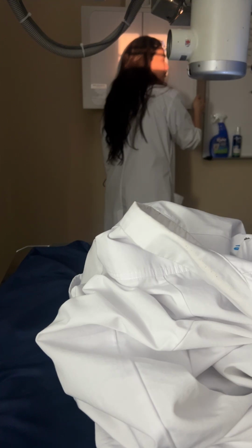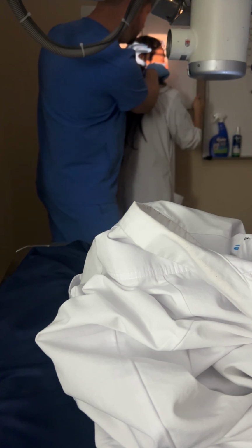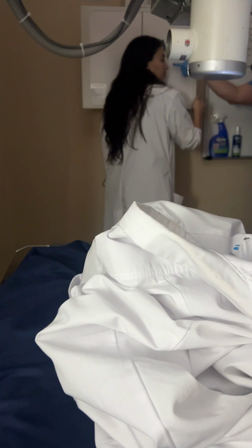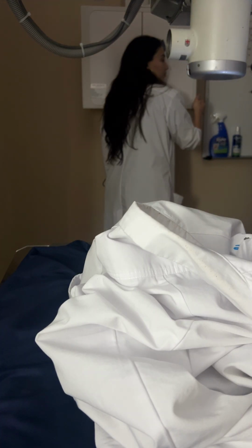Questions? So 2 lines. Infraorbitomeatal line is parallel to the bottom edge of my IR, and her interpupillary line is perpendicular to my IR. These two things are going to make sure that she is positioned correctly to make sure that there's no rotation or tilt. Okay? Questions? No? Okay. April, question? No. Are you sure? No. Okay. That's it.